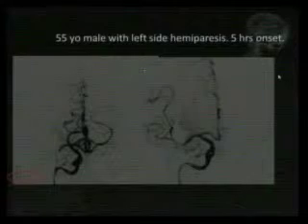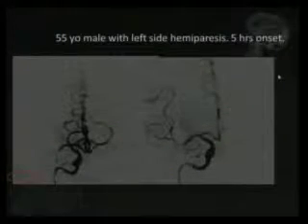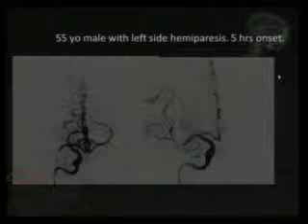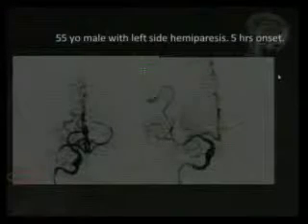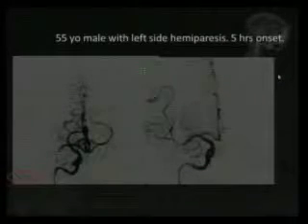We advance our microcatheter distal to the clot and retrieve this and deploy the stent. These little dots here are the distal markers of the stent. This is the proximal marker of the stent. One of the other advantages of this is once you open that stent, it creates a small path where you can start to have some reperfusion immediately, even before you retrieve the clot.